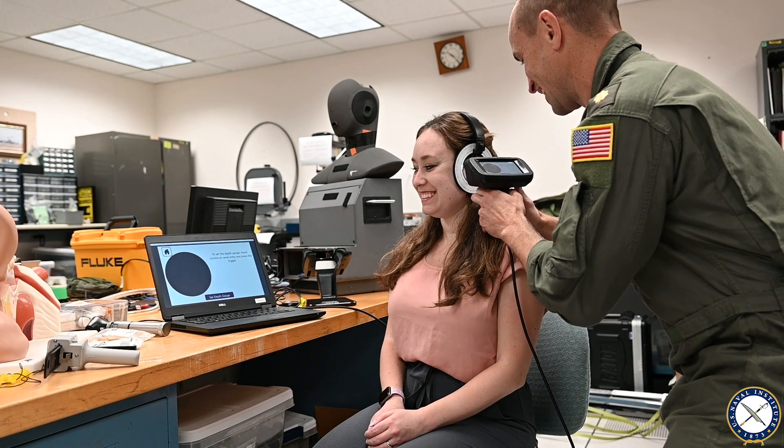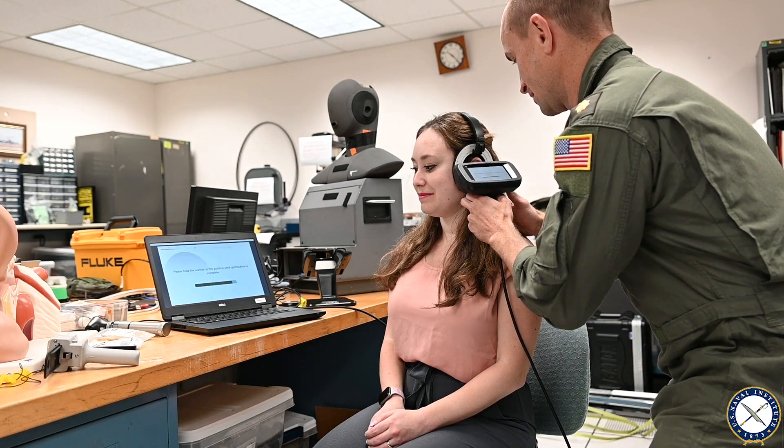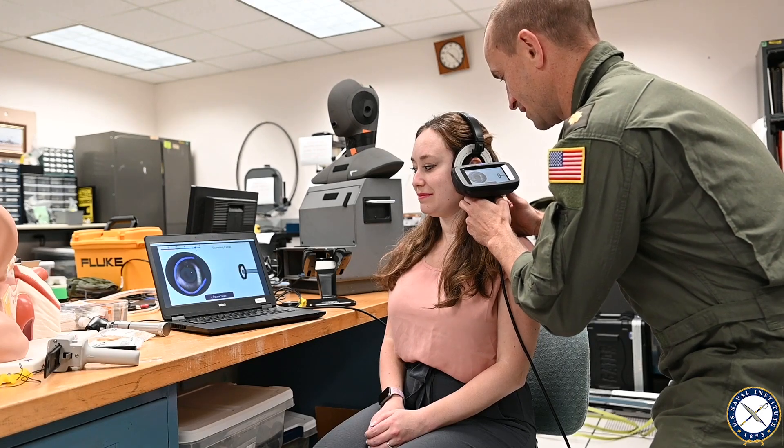A five-minute difference is not that big of a deal for one subject, but I've had days where I've done impressions on 100 aviators and that difference becomes significant. The real time difference is the logistical process of actually getting your custom hearing protection in hand. If we can cut that process in half because we're no longer physically mailing the impression, that saves time and money.